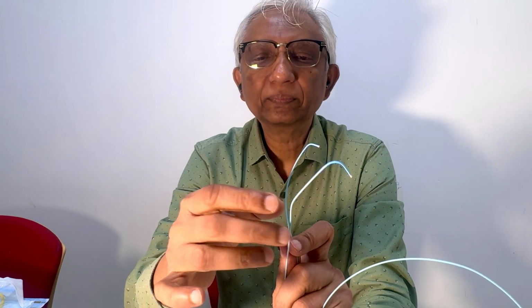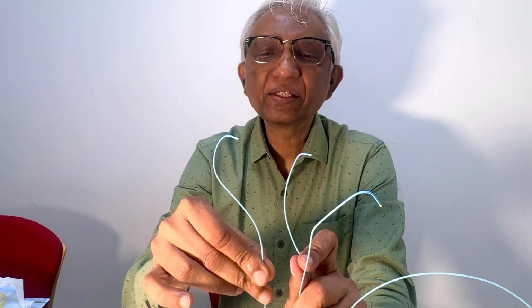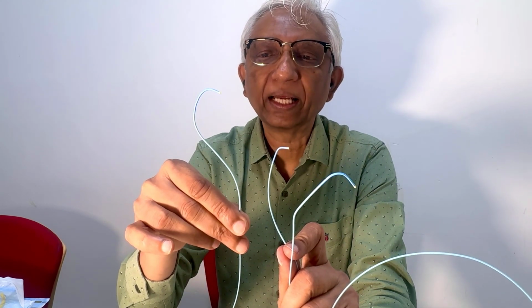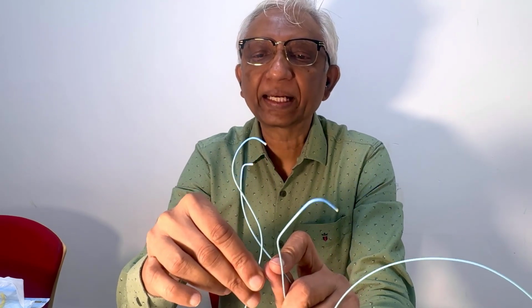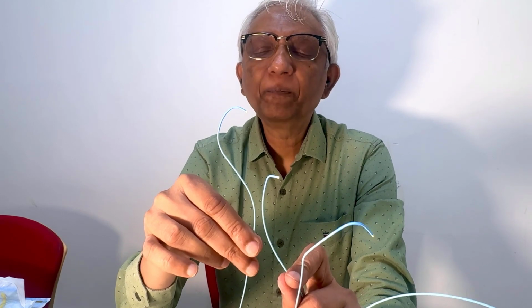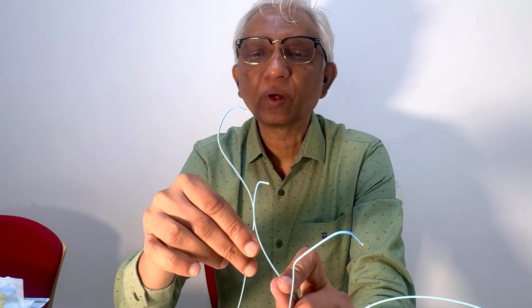Now, the other catheter here is the Cobra, right? Now look at this. This also is very similar to the double curve renal, except that the secondary curve is more gradual. And depending on the distance from the tip to the secondary curve, you will call it a Cobra 1, Cobra 2, or a Cobra 3. So what does the secondary curve do? It pushes the catheter onto the opposite wall of the aorta.